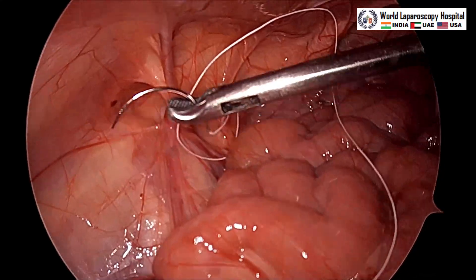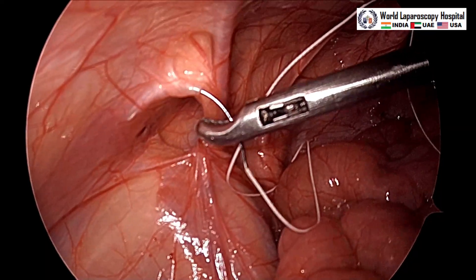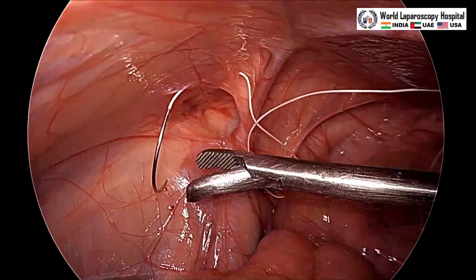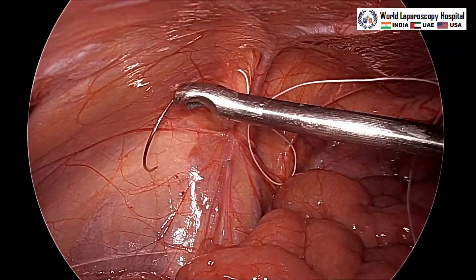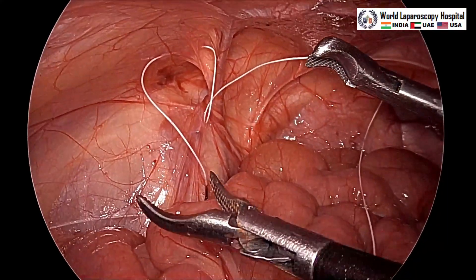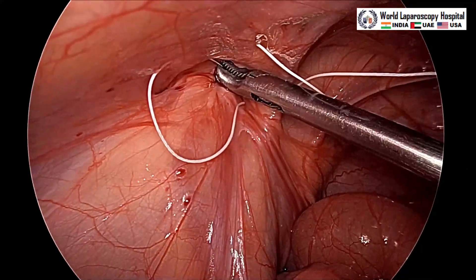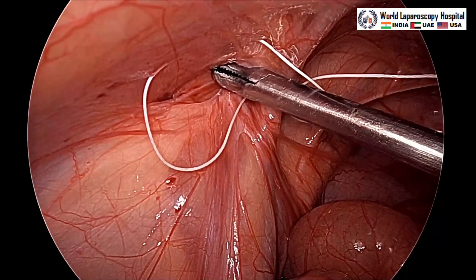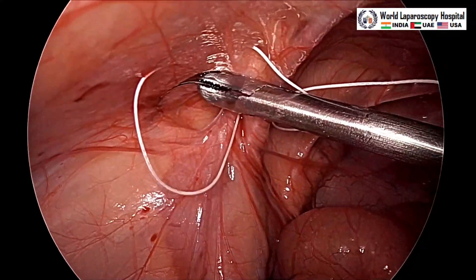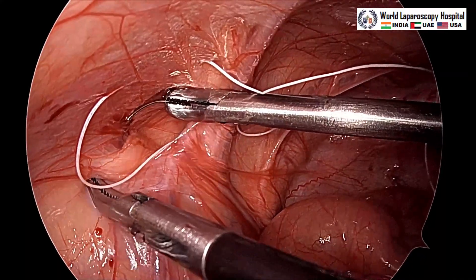Now we will start the purse string suture from the lateral side and we have to encircle the entire peritoneum all around. Suturing has started from the 10 o'clock position. You should not have any escape area — you should take the purse string thoroughly. Only peritoneum should be taken in this purse string. Care should be taken that the spermatic vessel, vas deferens, or iliac vessel should not be accidentally pricked.